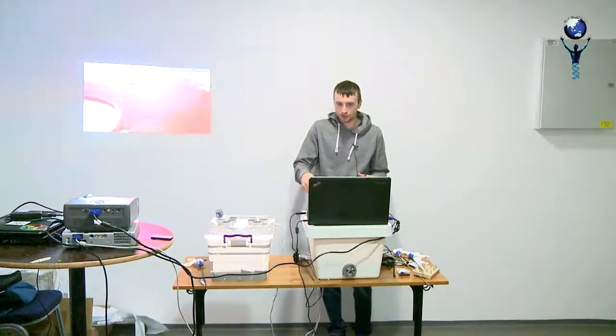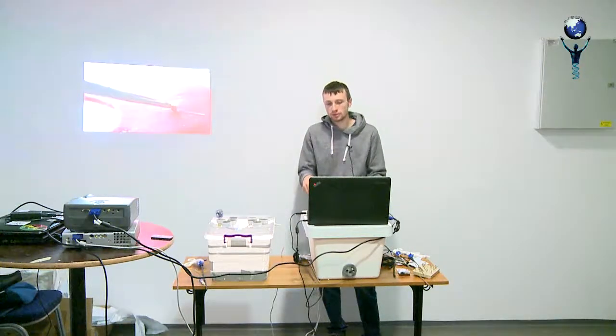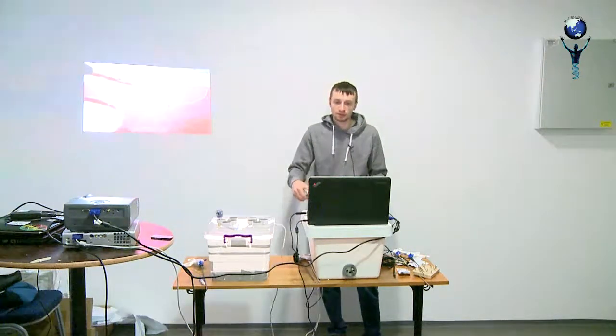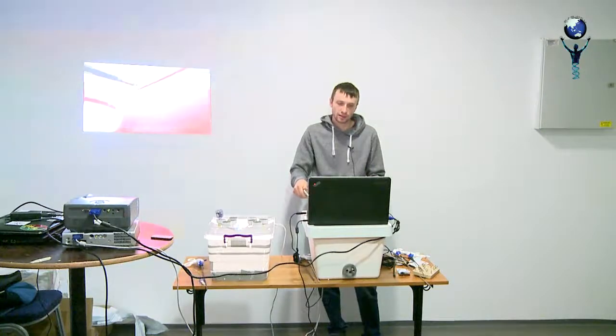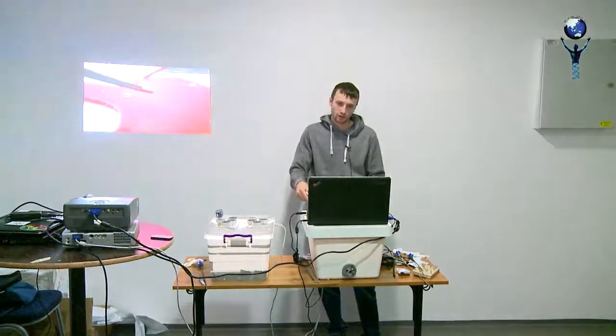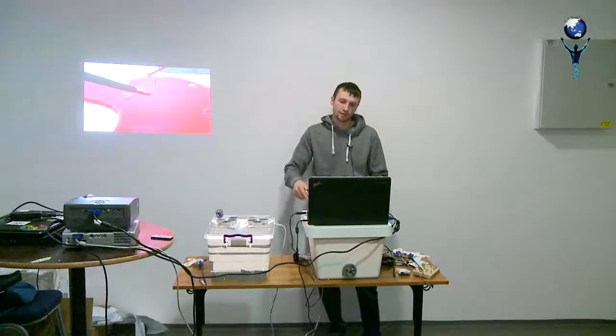So there are three exercises. The first one is called over and under wrap. It's a basic task for knot tying. So it's like this. The right instrument goes down, the left instrument goes down, and the right goes up, and then make a knot. It's like tying a knot with the instruments. Over wrap and under wrap is like this.